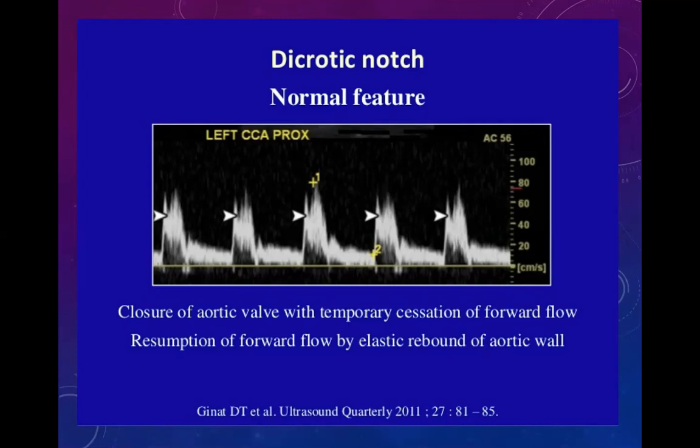That term doesn't apply. As Dr. Pish says, if you see this picture in the initial screening, that carotid is normal. And obviously, in the elderly population over 50, you expect some kind of disease. These forms are not going to be seen unless you scan a young patient. So to expect this kind of waveform in the carotid arteries, you have to scan younger patients. Otherwise, you're not going to see that often.